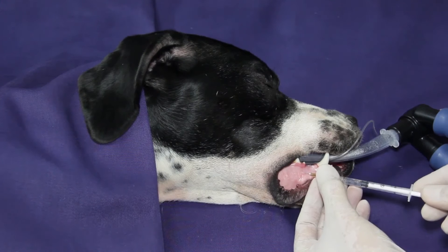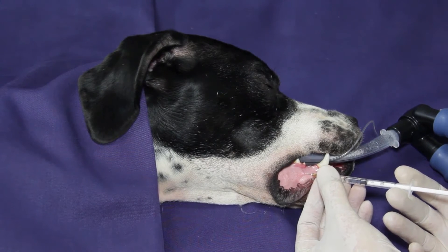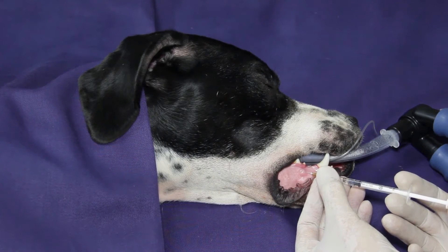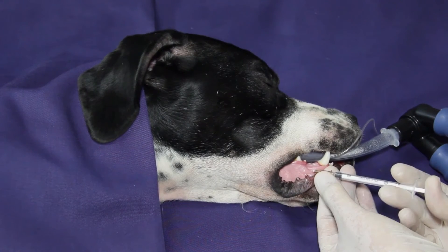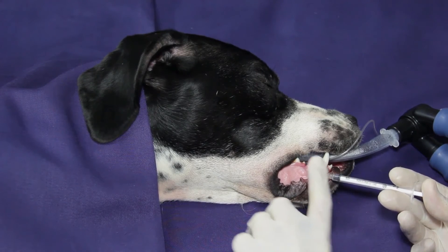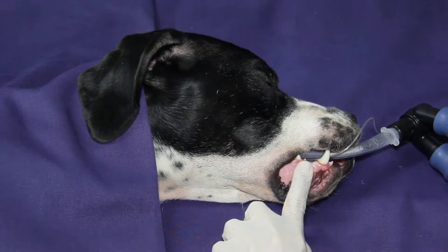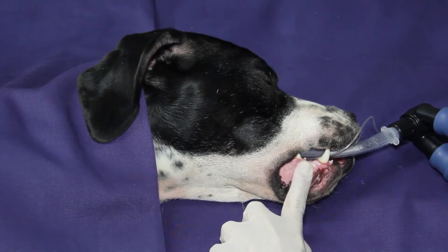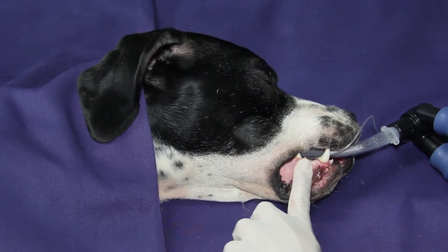Local anesthetic can only be injected after you have verified that the needle has not been inserted intravascularly. Injection inside the canal of the mental foramen will also produce anesthesia to the canine and ipsilateral incisive teeth. Application of a finger over the entrance to the foramen during the injection will encourage the local anesthetic to move along the mandibular canal.